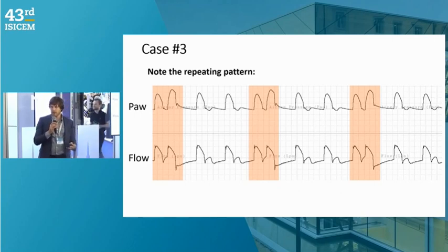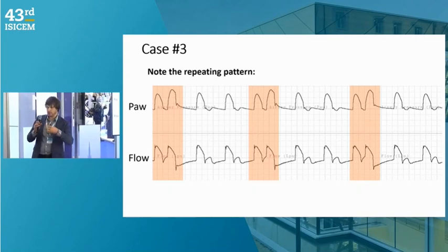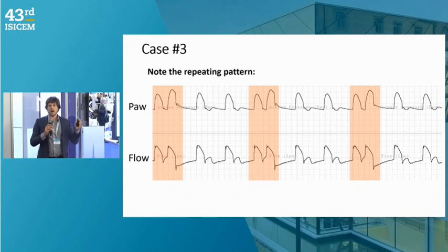It's a rhythm phenomenon. So when you're looking at the waveforms, it's really looking over time and trying to see if there's a very clear pattern. Because if it's a respiratory drive related phenomenon, if it's from the patient having high respiratory drive, oftentimes that's less rhythmic, right? We have conscious control of ventilation, it can be more sporadic.